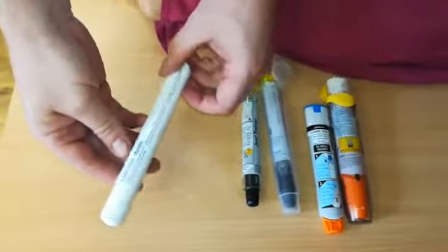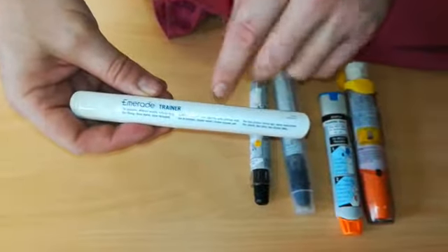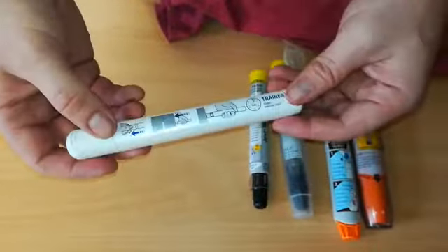Now the Emerade trainer. Again, you're looking for the lot number. I don't have one that's been fired for this one. And we're looking to make sure there's no discolouring.